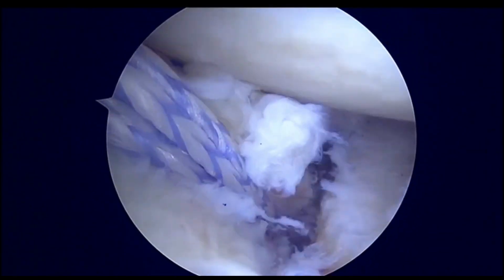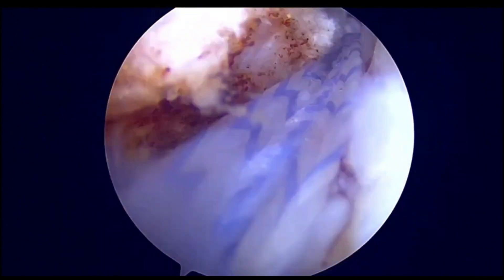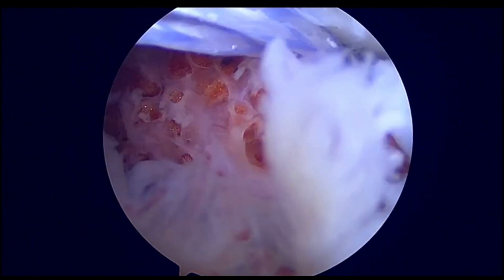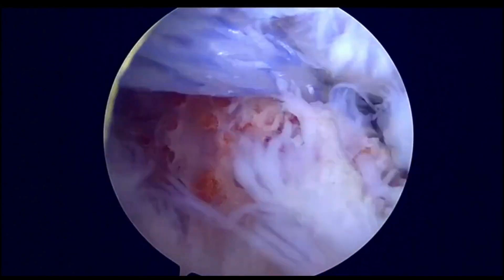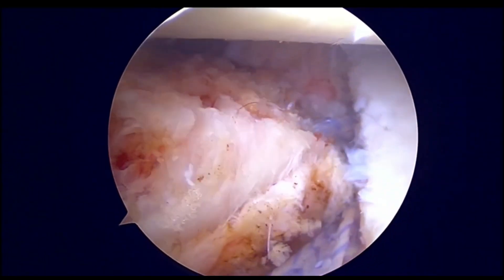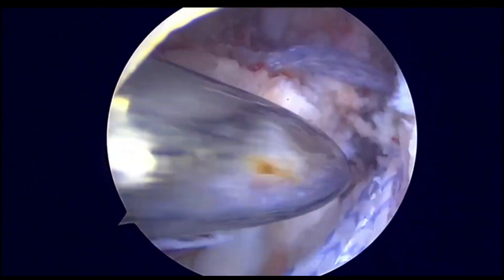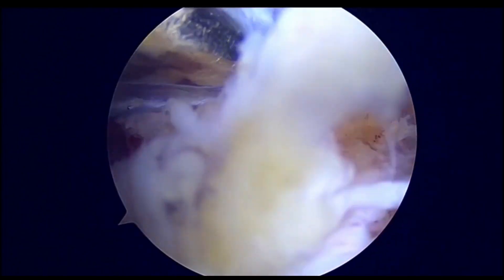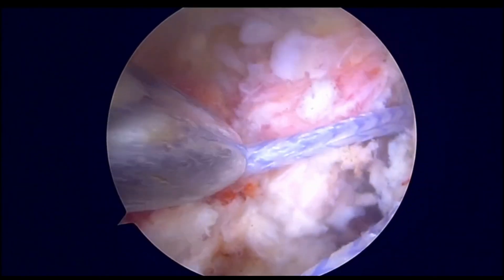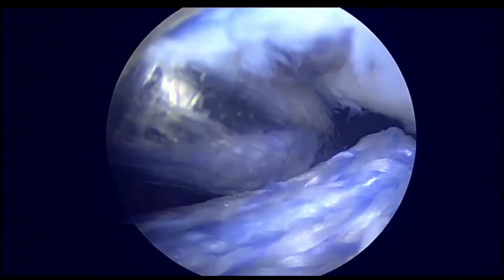Once everything is in place, we will pull the fiber tape and cerclage system to reduce the bone block into position. Here we can see that we are pulling the bone block to reduce it into its place. A very good trick to prevent entanglement of the fiber tape and cerclage system is to pull only one side of the fiber tape and use a simple fiber wire on the other loop so that it does not entangle. The inferior fiber tape and cerclage is now in its place, and the superior fiber tape and cerclage is also in its place. The wire which is there serves as the preventive wire to prevent entanglement.